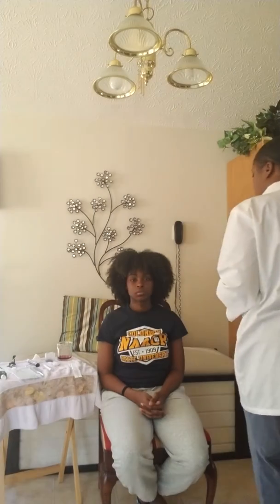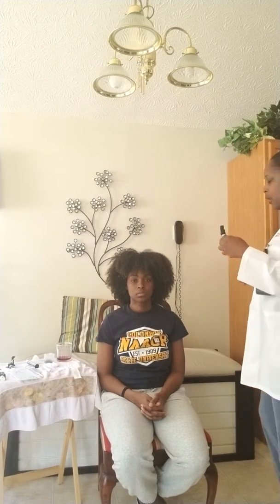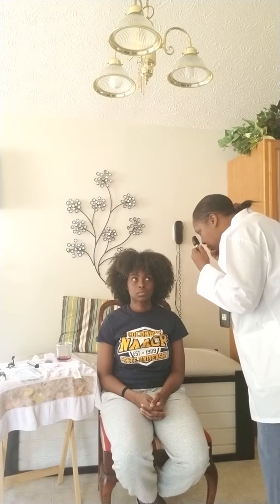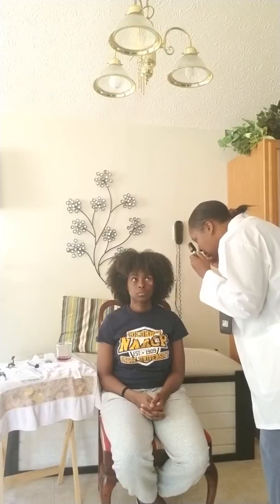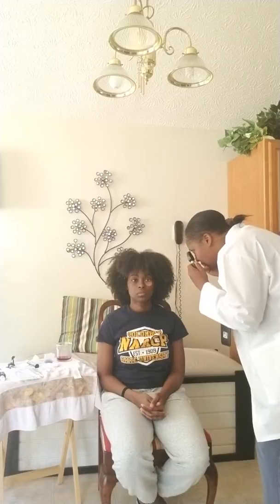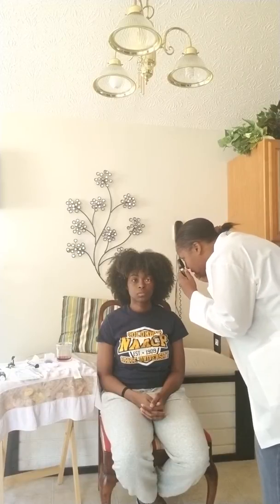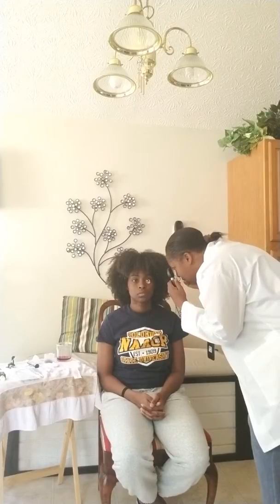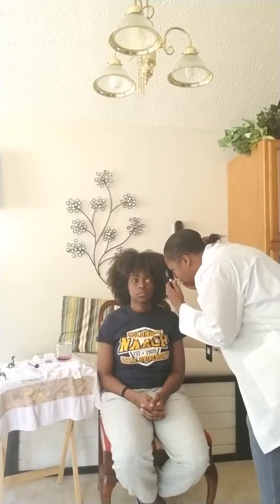And then what we're going to do is the other side. If you notice, I'm going to change my hands so that I'm at the same eye level with her. It takes some practice to actually get it focused, if you have never really done this. Once you find the red eye reflex, you just come on in closer. It's kind of bright in here because I have to make sure the lighting is good for the camera, but normally you do this in a dark room.